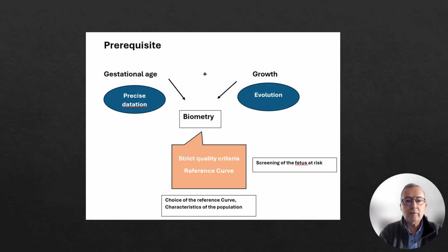The essential prerequisite for the evaluation of fetal growth is to have an accurate gestational age. Then we will evaluate this growth using strict criteria and reference curves. And we will revisit this problem of the reference curve later if we want to screen the fetus at risk.